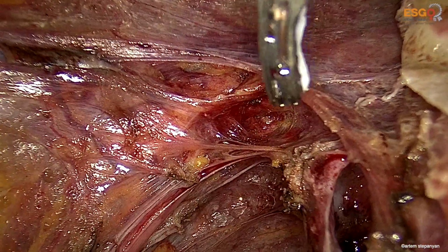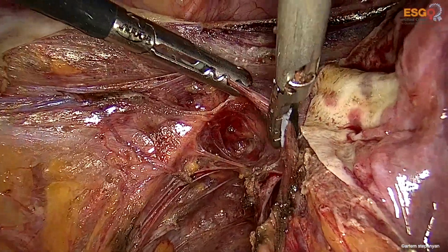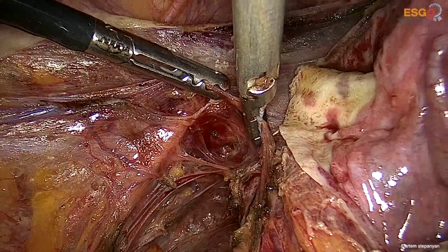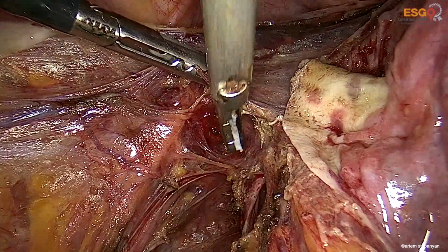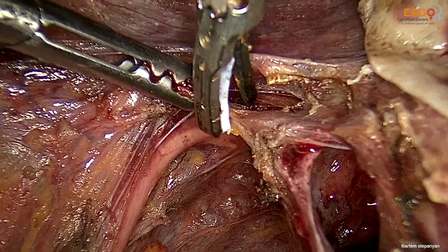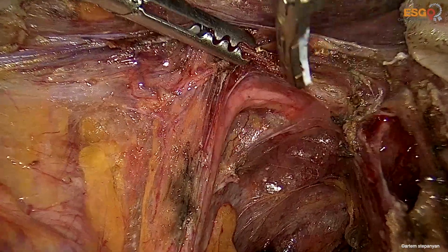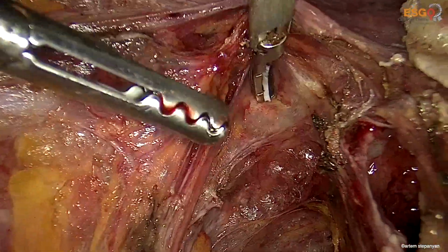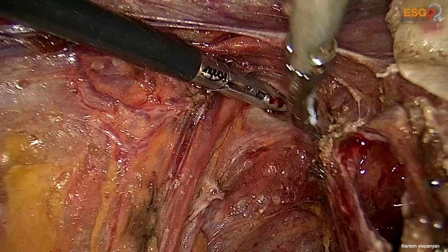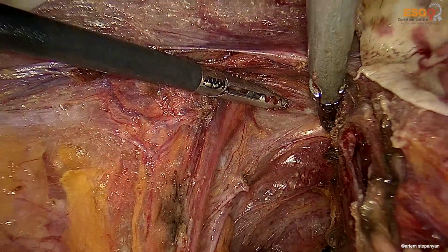Again, closer to the ureter, we shift to harmonic. And now we're seeking the uterine vessels, which are crossing the ureter.